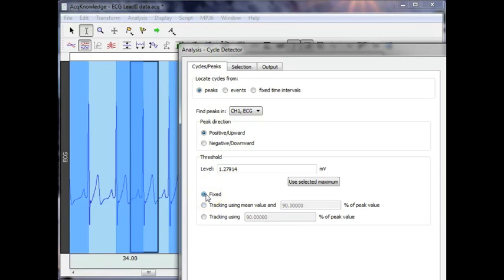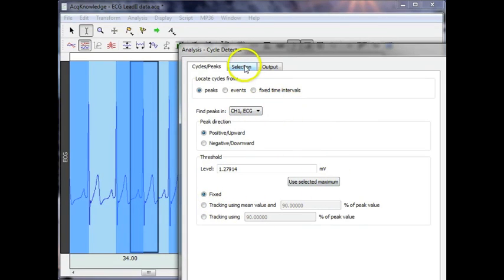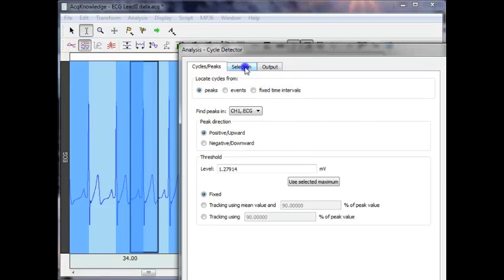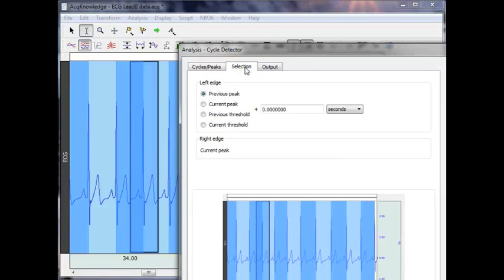For this particular example, we're going to use fixed. So that's all you have to do on this first section of the dialog. The next thing we're going to do is advance to the selection tab.